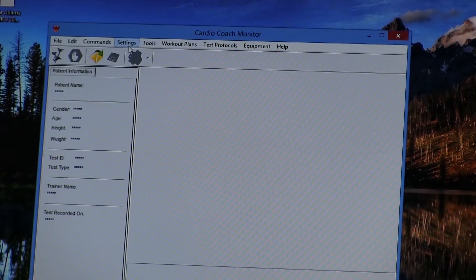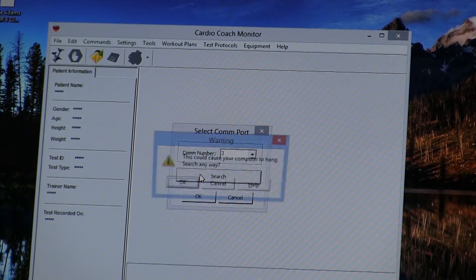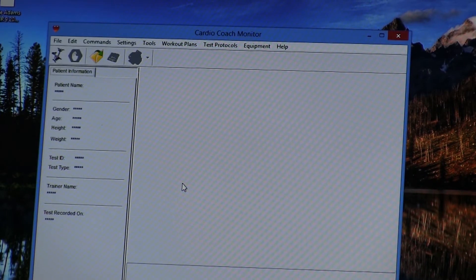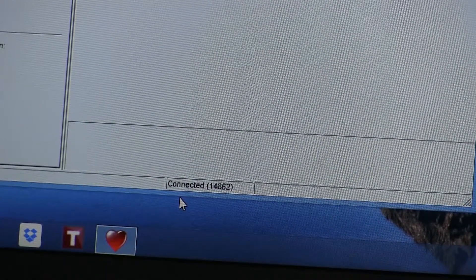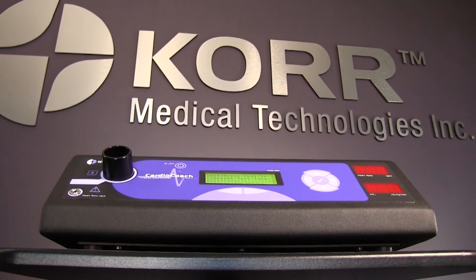If the software says disconnected, simply click on the Settings tab, then COM port, and then Search. Click OK on the prompt and the software will search for the CardioCoach. Within a few seconds, you should see the word connected at the bottom of the window. Once your CardioCoach is connected, you are set up and ready to go.